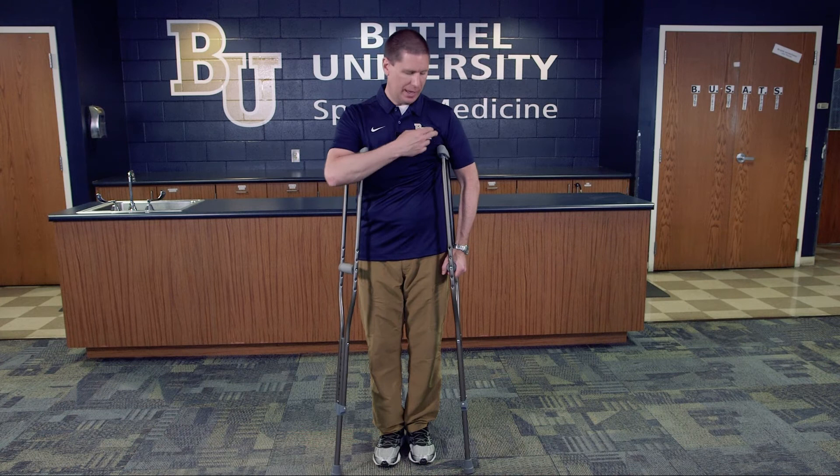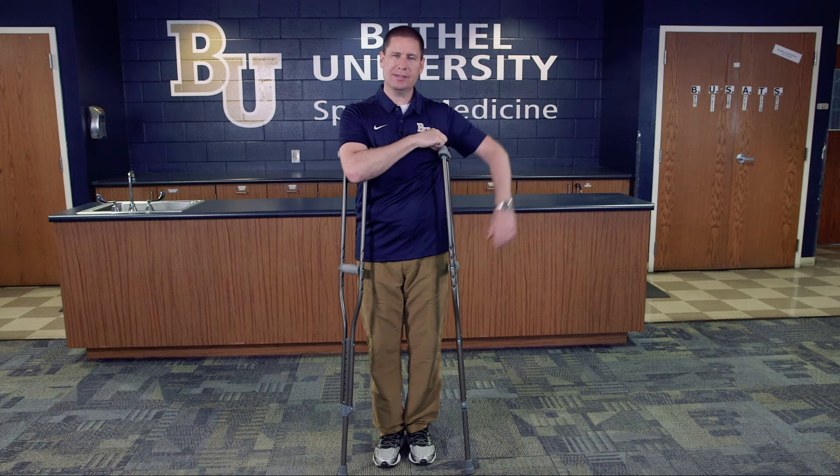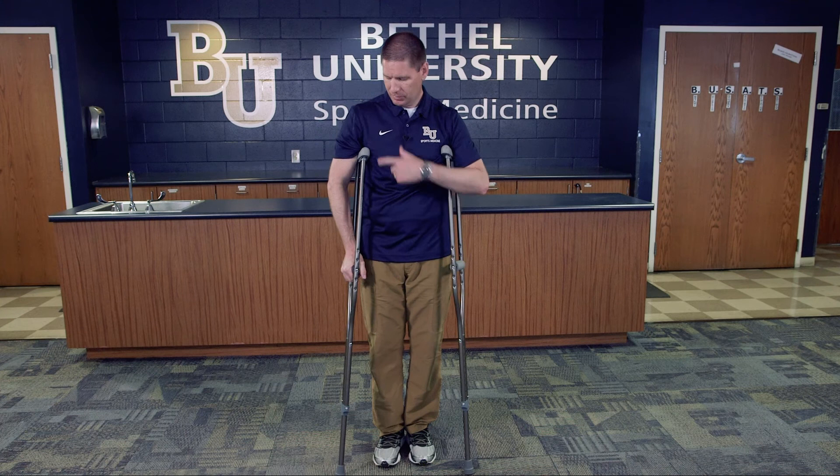A couple of key things to check: you want at least a two-finger width distance between the top of the crutch and the top of the armpit. You don't want it too high and you don't want it dangling too low — you want it at just the right height. Make sure it's the same on both sides.